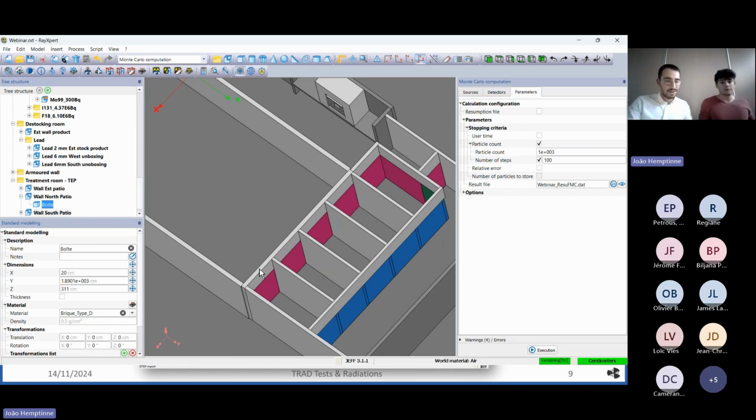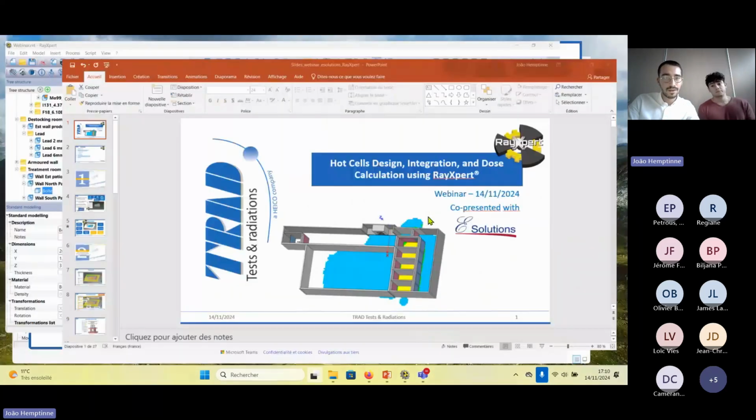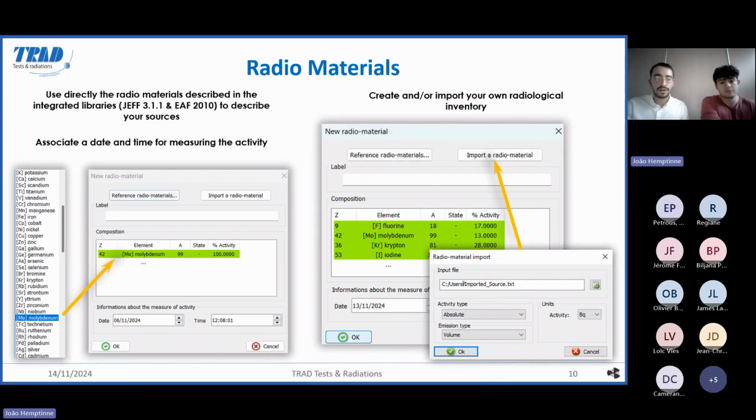Thank you, Leo. Great introduction to the next part of my slides. Here we can speak about radio materials. When you finish modeling your facility, equipment, anything, you want to start setting up your radioactive sources. The first step is to choose your radio materials. You have many ways to do it. First of all, you have integrated libraries inside RayXpert. You can have the references here that help you describe your sources.